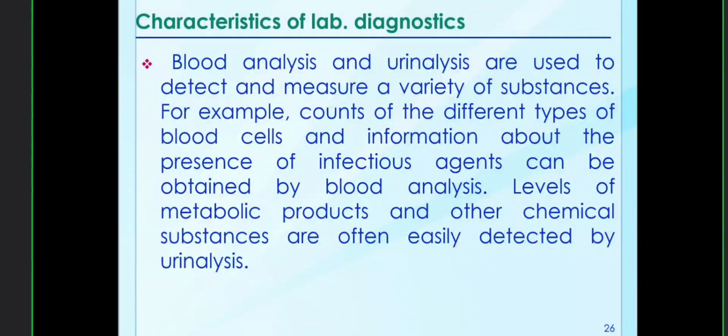by blood. Levels of metabolic products and other chemical substances are often easily detected by urinalysis.